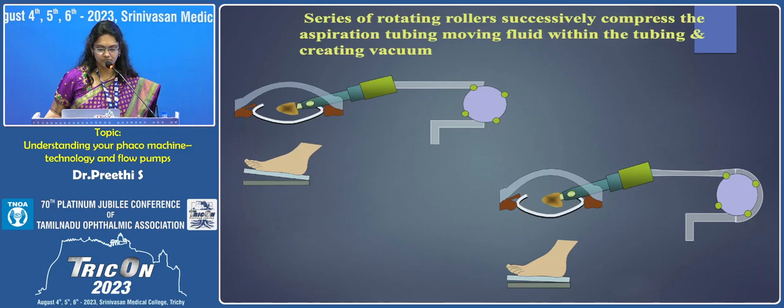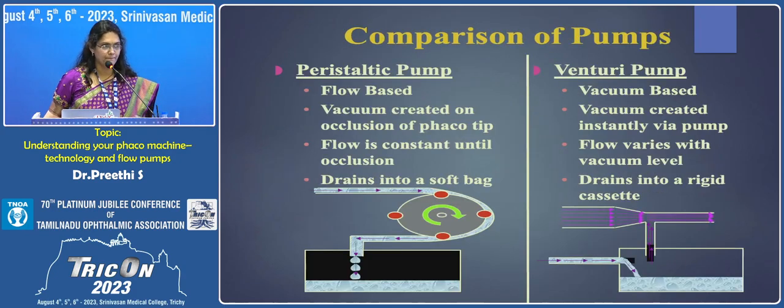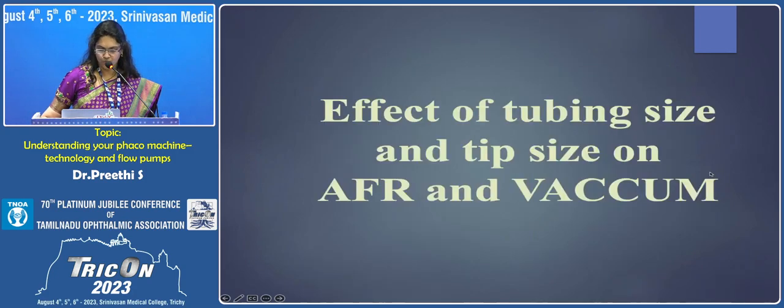Basically, there are two types of pumps which help in the fluid flow and generating the vacuum. This is a peristaltic pump. In most of the machines currently, it's all an upgradation of this pump. So we should know what a peristaltic pump and a venturi pump are. In a peristaltic pump, with the movement of rollers, the vacuum is built and it drains into a soft cassette. And in a venturi pump, it is by gas flow and it drains into a hard cassette. Flow is constant until occlusion in a peristaltic pump, and flow varies with the vacuum level in a venturi pump.